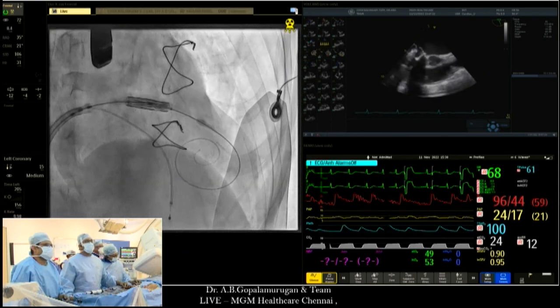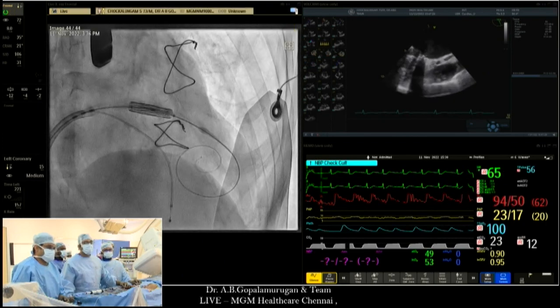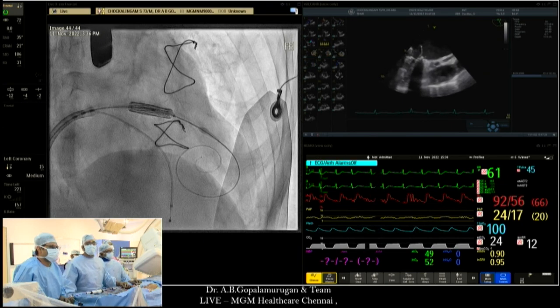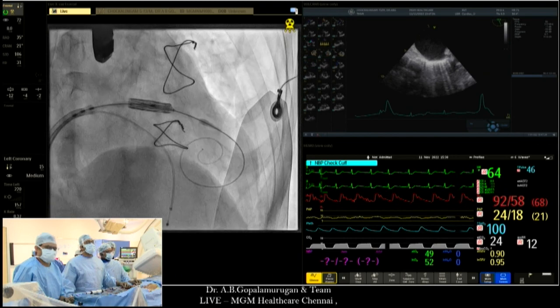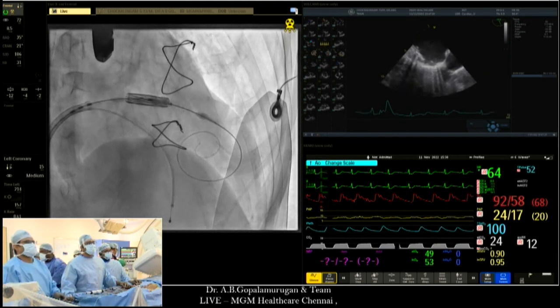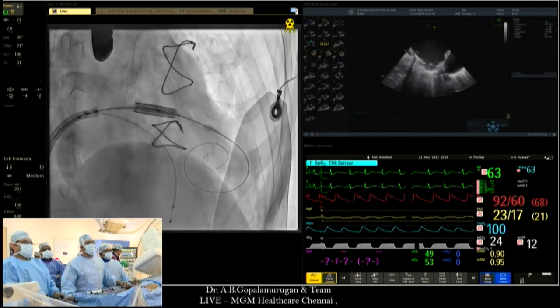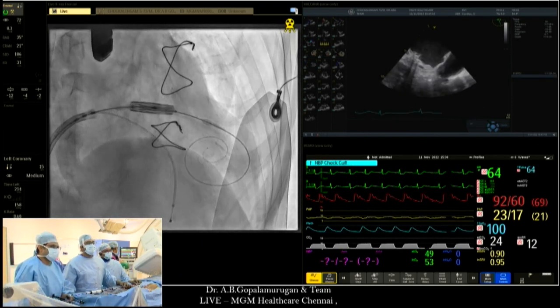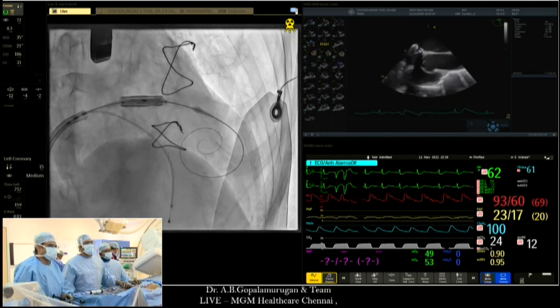Okay. So we're just doing our final checks. That is routine. We just make sure somebody is there for CPR. Make sure the defib is connected because there is a good chance you'll end up in VF. You're going to run a long pacing drive. And we make sure ECMO is available should we have to go on pump support. So it's key all this is available and ready, and all the teams are well-oiled and ready to go. And there's a risk of embolization, where we're going to try and make sure we don't get any of those.